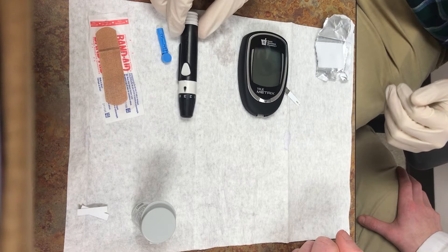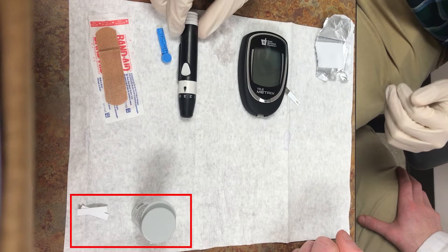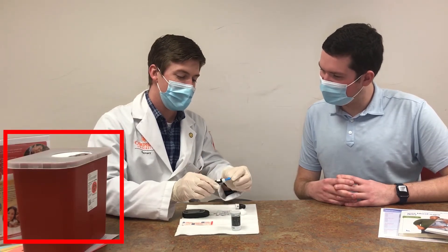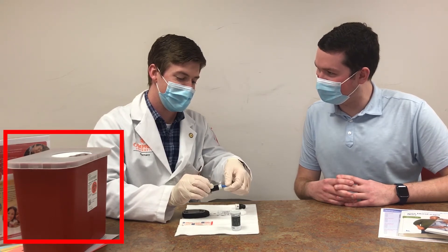To measure your blood glucose at home, you will need a glucose meter, testing strips, a lancing device, lancets, alcohol swabs, bandages, and a sharps container. This can be purchased from a medical supplies store, or you can use a hard plastic container such as a milk jug.